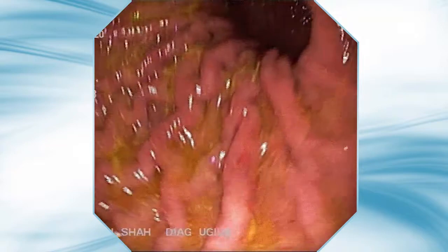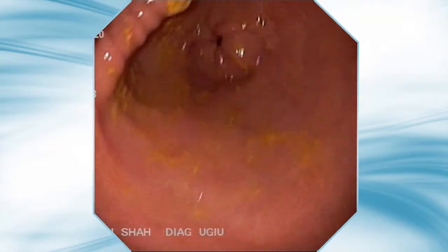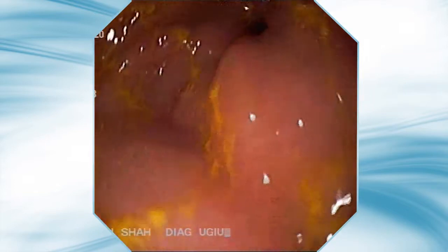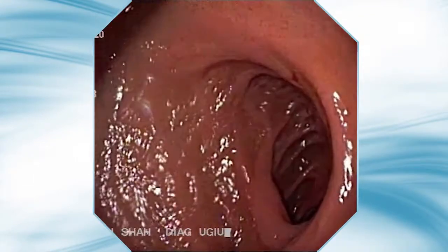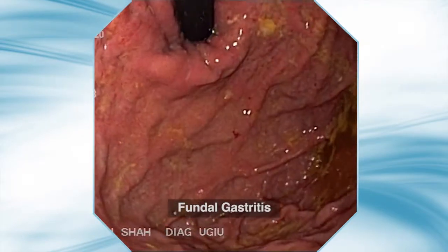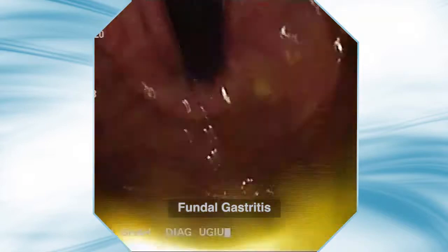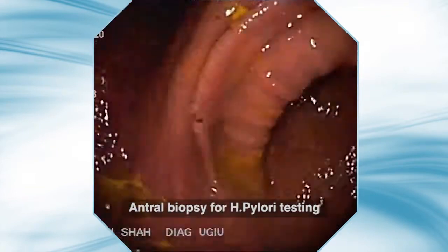This is an endoscopic view of the stomach showing some food particles. Active duodenal peristalsis are visible. On retroflexed view, fundal gastritis is visible. A biopsy is taken from the antrum for H. pylori testing.